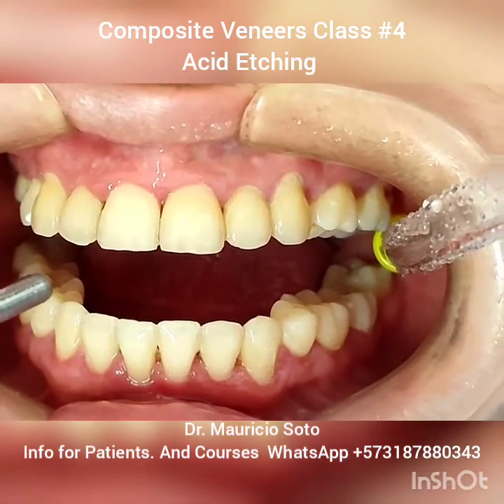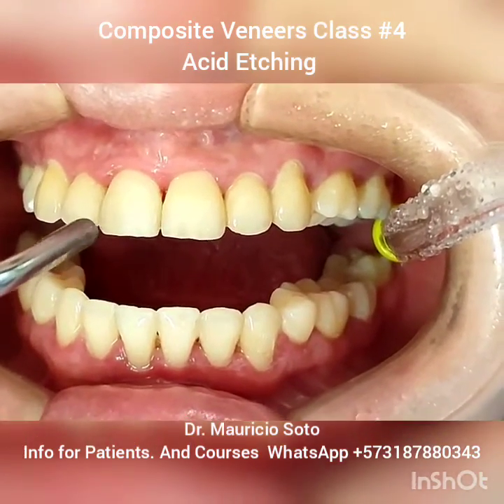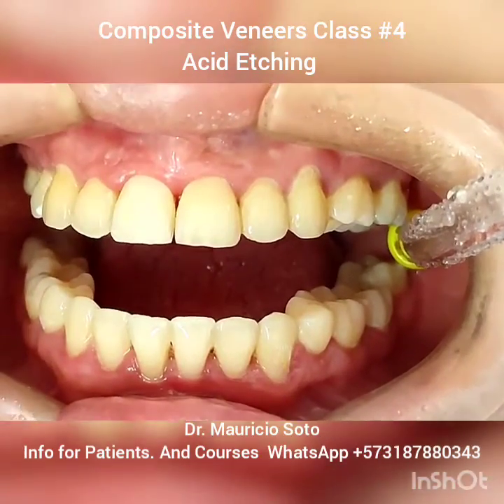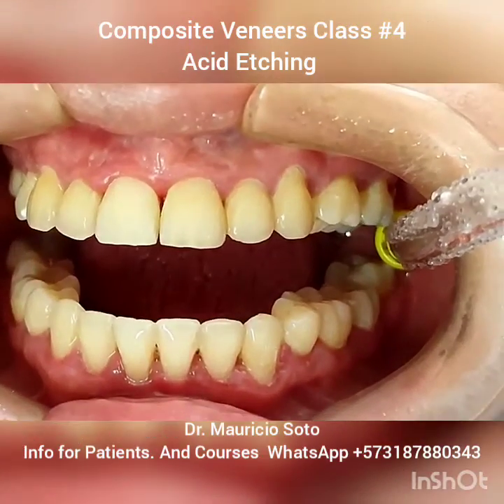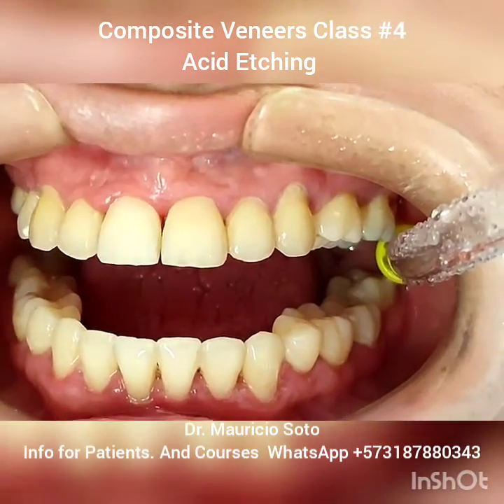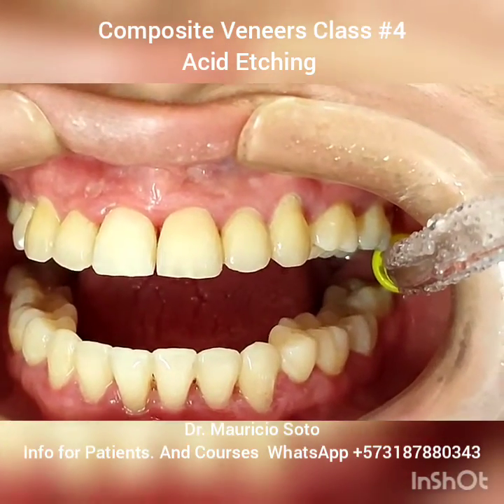After washing with water, we dry very well. And if the acid etching is well done, we lose the shine in the enamel — in this way.